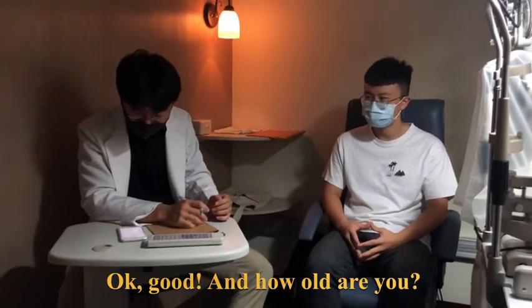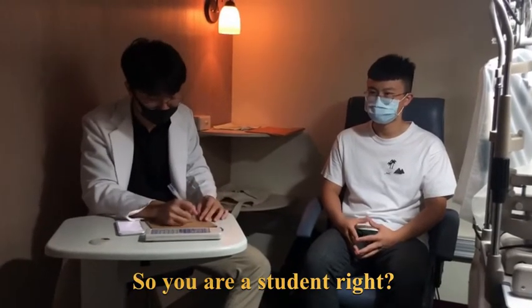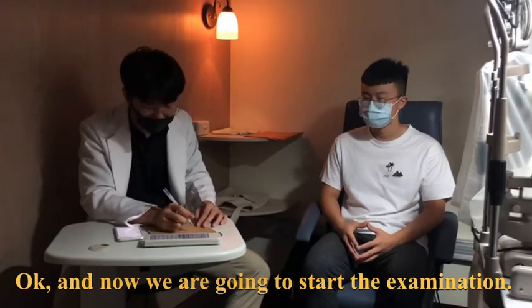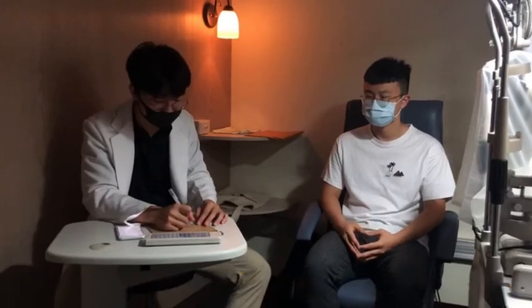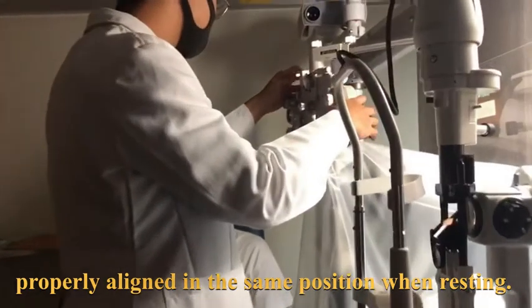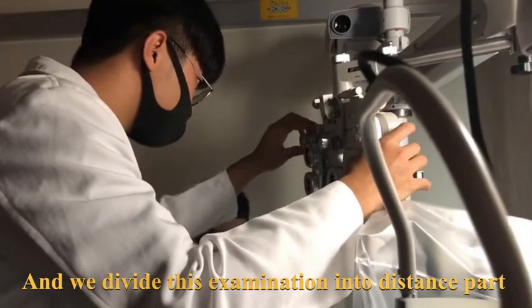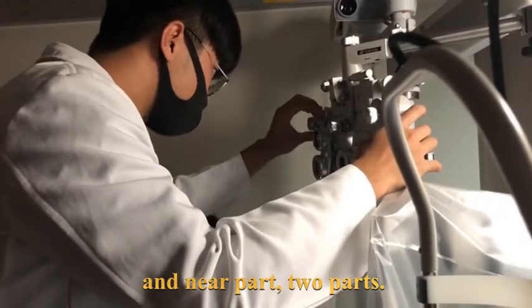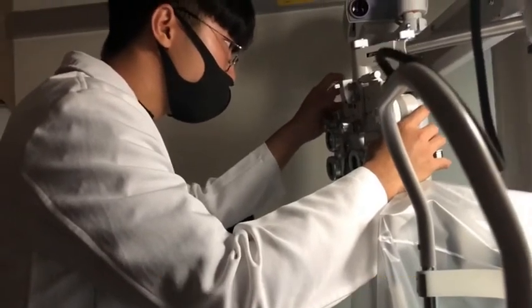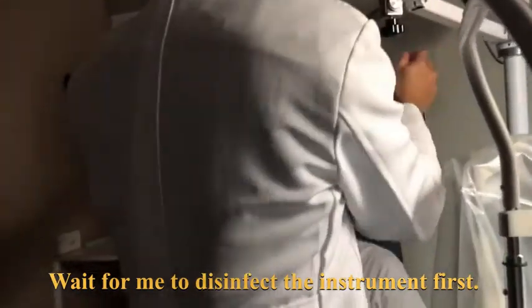And how old are you? I'm 20 years old. So you are a student, right? Yes, I am. Now we are going to start the examination. We are going to check whether your eyes are aligned in the same position when resting. We divide this examination into a distance part and a near part. We will do the distance part first and the near part second. Wait for me to disinfect the instrument first.